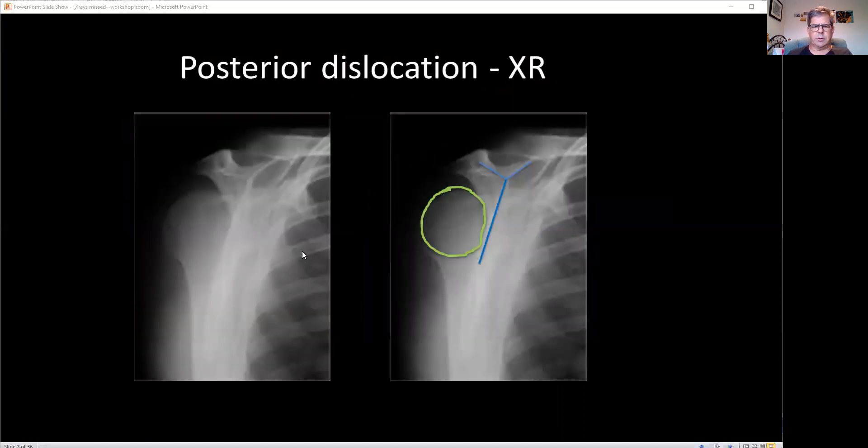If you get a lateral — this is a different patient — you'll see the Mercedes sign: the head is behind the glenoid. The head should sit in the glenoid of the scapula. So there you can confirm your posterior dislocation. This is one that is still intermittently missed or at least delayed in diagnosis.